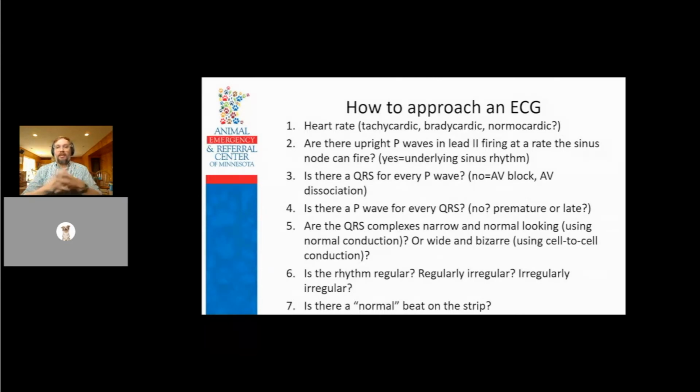And then sometimes if it's a really overwhelming EKG with a lot going on, I just say, okay, is there a nice home base? Do I see a nice normal sinus complex, a PQRST that looks normal? So sometimes I'll search and say, okay, look, there's a normal sinus complex. Now I can extrapolate out, look for others of those, look for other components. So sometimes I'm just like, is there anything here that I do recognize?